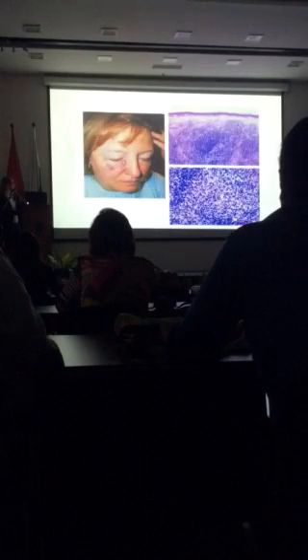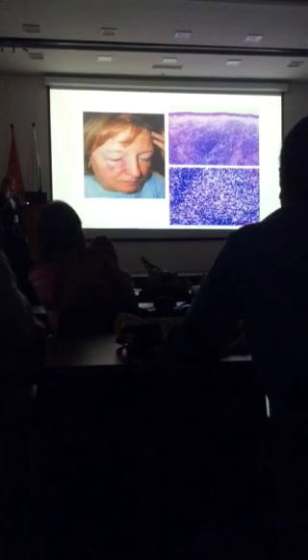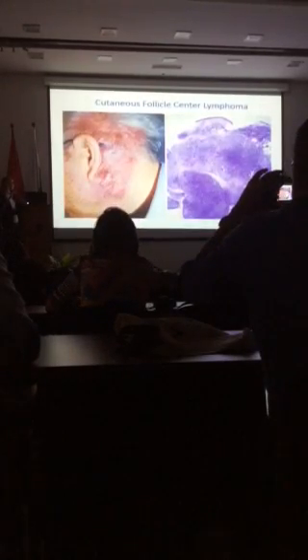This is reminiscent of a follicle. It's a germinal center here, predominantly of centrocytes, a few centroblasts. This is another patient of mine who has a really heavy infiltrate. We do find, again, as I mentioned, follicular structures, generally more centrocytes and centroblasts.